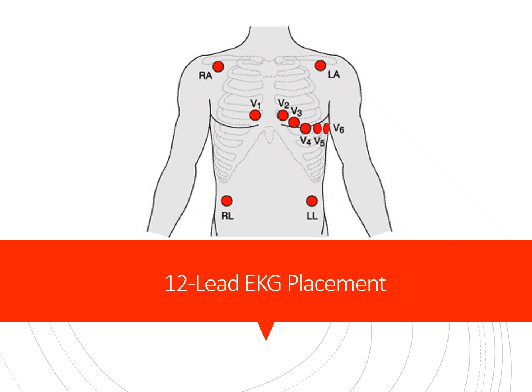Now let's switch gears just a little bit. Correct lead placement is absolutely critical in EKG interpretation. An improperly placed lead can mimic or hide dangerous cardiac conditions, including myocardial infarctions. That's why every emergency nurse must be confident in accurate electrode positioning.